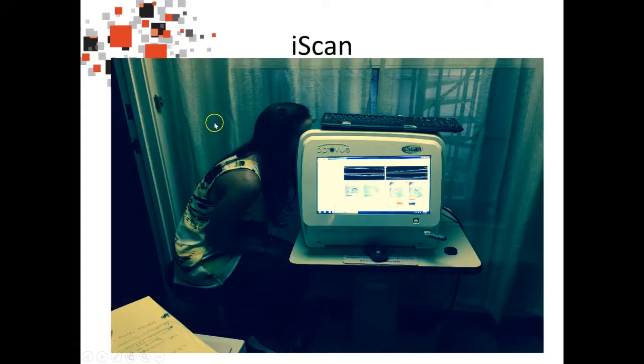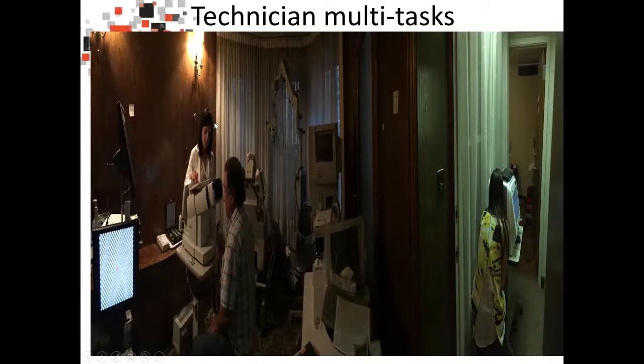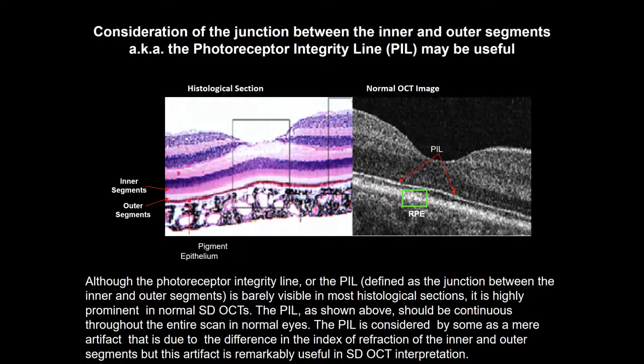And we use one of these in one of our offices in Manhattan. And it works out quite well. We do it on practically every patient. Here we actually have an image, which was taken with an iPhone, of one of our techs running, and you can see it's a panoramic image. So here's the same patient being OCT'd, if you will, on the eye scan, and while this technician is also setting up a patient over here on a matrix, and over here further to the left is a VEP instrument, and setting up a patient on a VEP. So we like technicians who are multitasking, who can actually go from one instrument to another and run 2 or 3 patients simultaneously, and that works out okay.